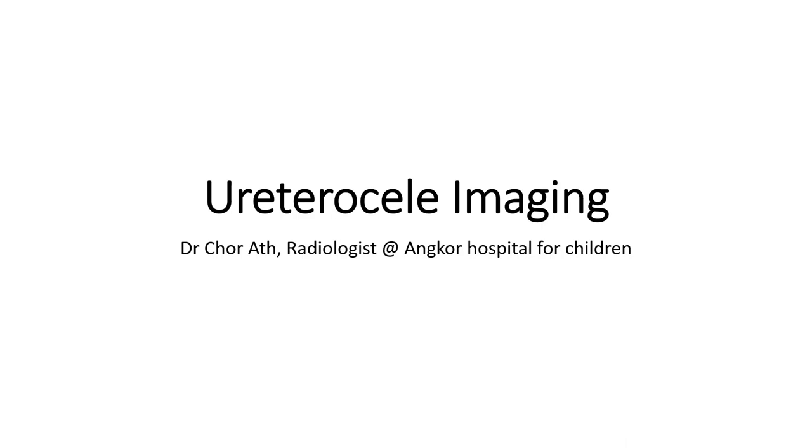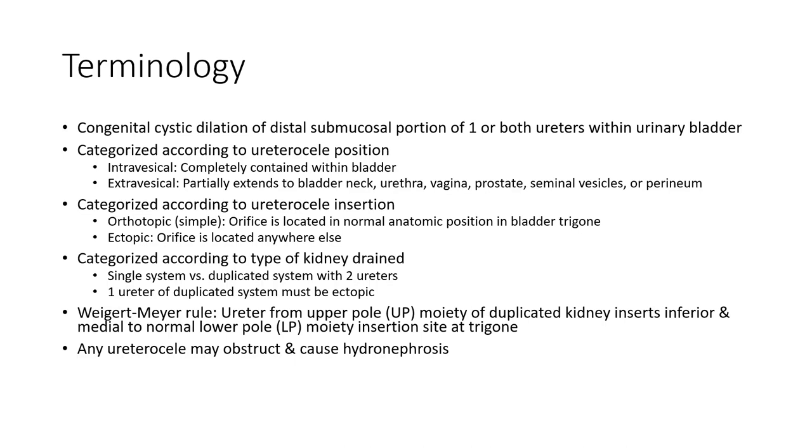Hello everyone, today I'm going to show you about ureterocele imaging. Terminology.